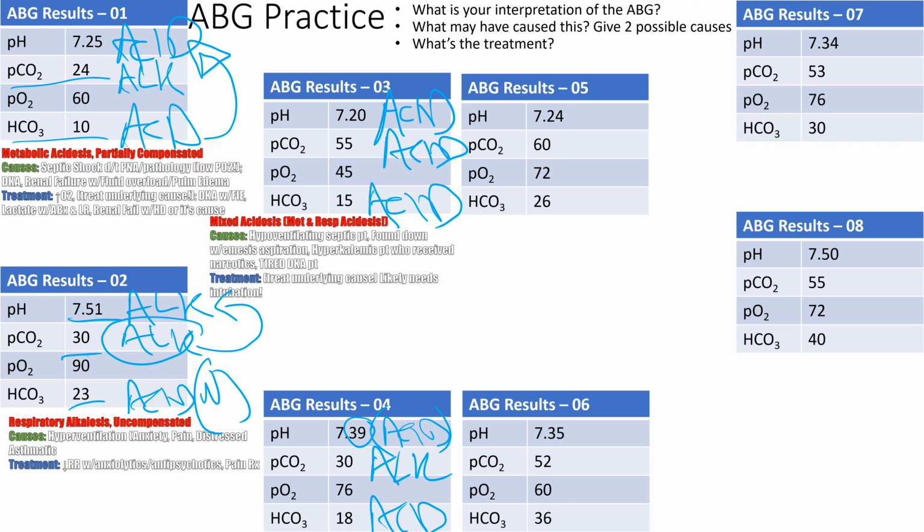Who fixed it? What happened first? Is it metabolic or respiratory acidosis? It's a metabolic acidosis. Bicarb is acidotic, right? That's the one that caused this problem, right? So you have metabolic acidosis. The CO2, did it fix it? It did a great job. It absolutely fixed it, right? So that's a compensation, right? Of what variety? Partial, full, or un? That's a full compensation. Yes. Do you need to treat fully compensated things, or looks like your body fixed it, or you gave the fix already, right? So yeah, what might have been the cause of this?